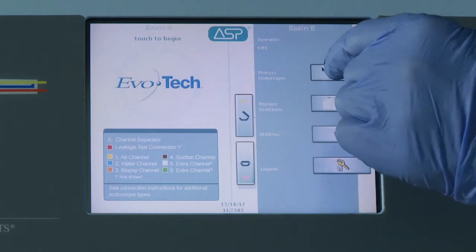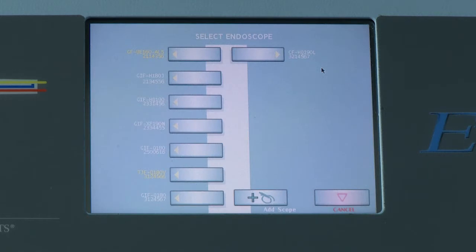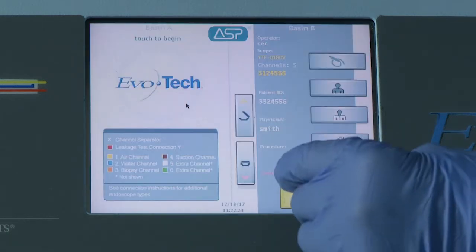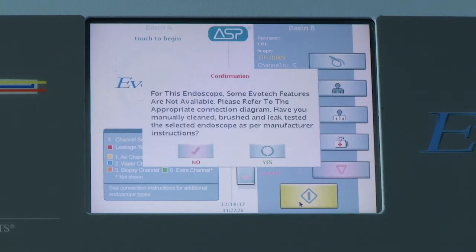Certain scopes have been validated by ASP for disinfect only. If this is the case, the scope will appear on the EVOTECH scope drop-down list in yellow font. Before running the disinfect only cycle, a prompt will ask if you have manually cleaned this scope. You must respond yes or no before the unit will allow you to proceed.